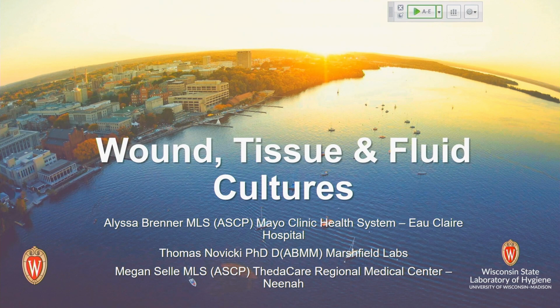Everything got sent to us. So they were not being plated in a timely manner because there were delays in courier transport, then receiving them in, and when they finally get to us, especially if it's a weekend where you have fewer couriers going, it can be a good 12 hours before we get specimens. So how do we balance that with the push towards more automation?